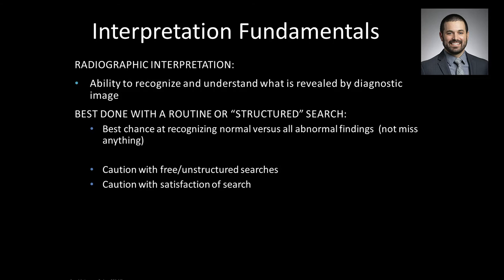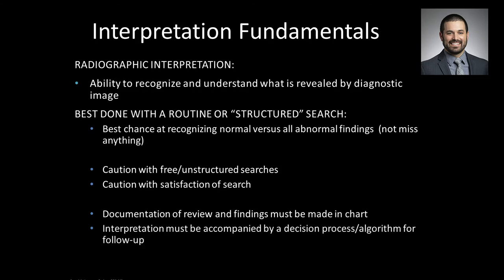So a great radiology teacher of mine told me, stick to your routine, stick to your structured search. And as soon as you find something interesting, whether it's what you were hoping to find or thought you were going to find, or whether it was a surprise incidental finding, put it on a shelf in your brain and finish your routine. And then when you're all done, go back and address the interesting findings. And then, of course, you have to document that you did that review and the relevant findings in your chart, because if you didn't write it down, of course, you didn't do it. And then, of course, we also need some decision process for what to do if you do find an interesting finding.